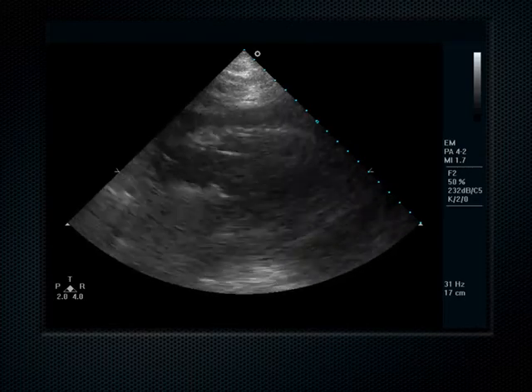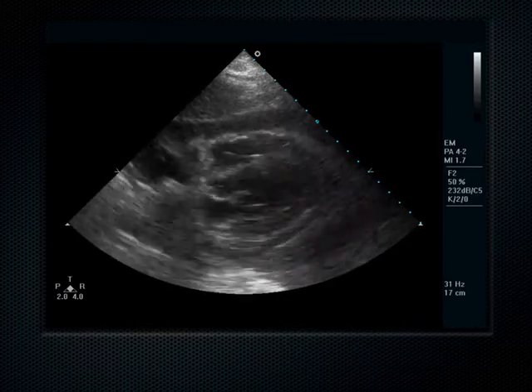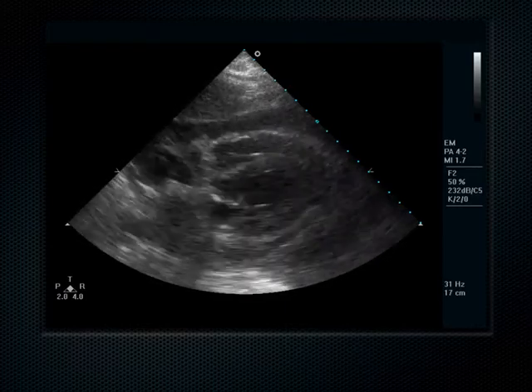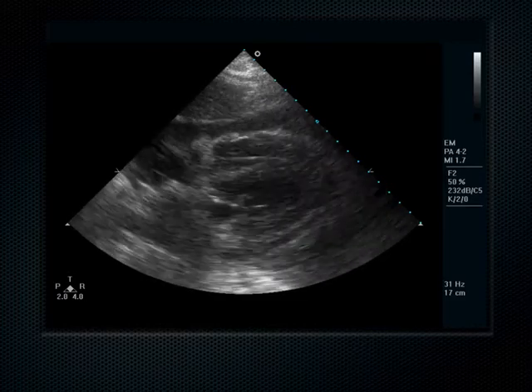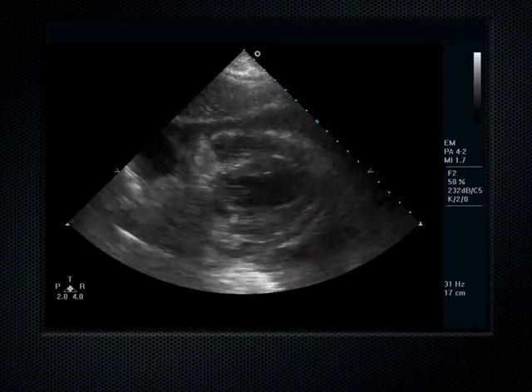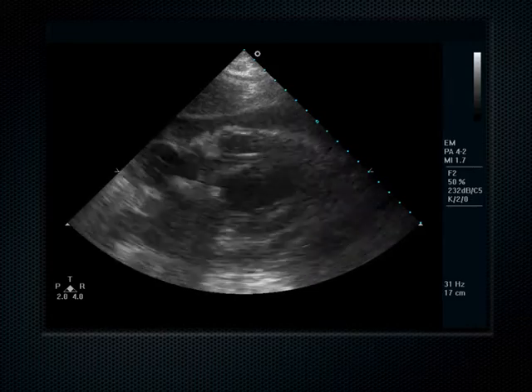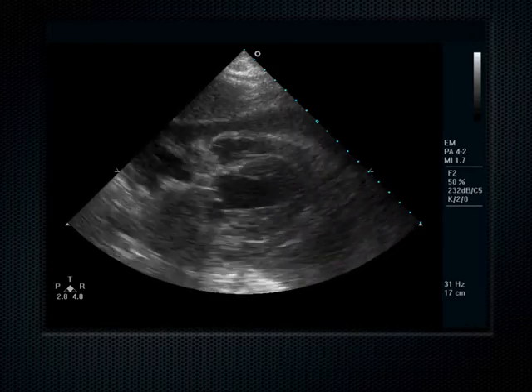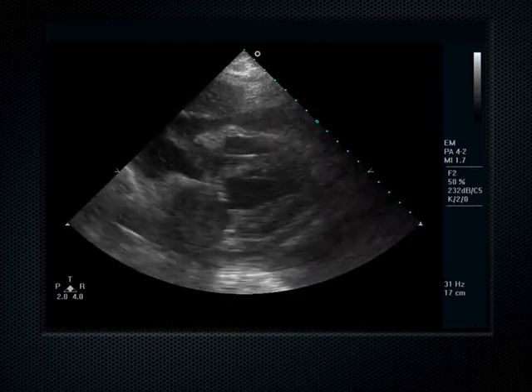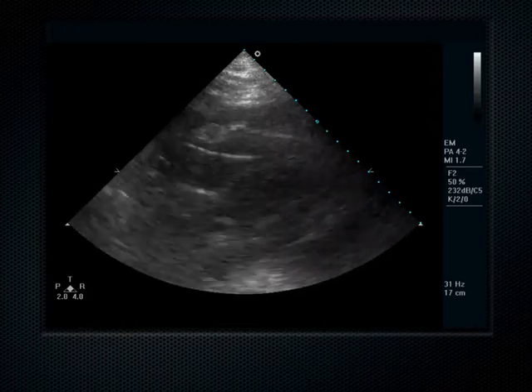Turns out emergency physicians have a pretty low success rate of floating transvenous pacemakers blinded. You watch cardiologists do it, they do it like they could do it in their sleep. They do it like they're blinded. But they're so good at it. But emergency physicians, we struggle with this. Every once in a while, you get the patient who you can't transthoracically pace, and their blood pressure is very low because of the bradycardia, and now it's time to fix that with electricity, but transthoracically, you just can't do it. So then that's the indication to do a transvenous pacemaker. There's a couple of others, but that's the main sort of clinical pickle that you end up in.